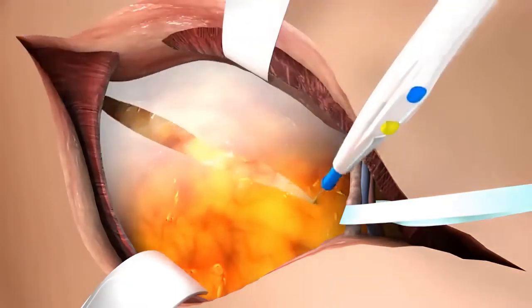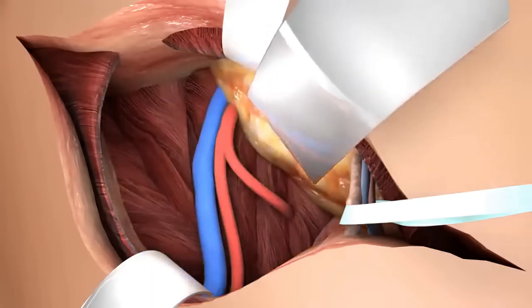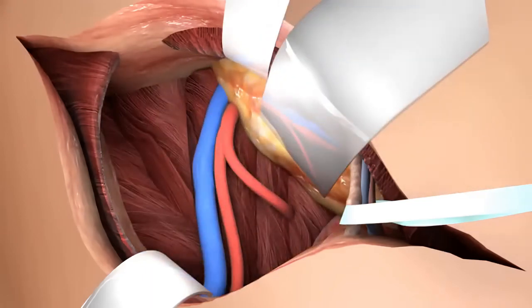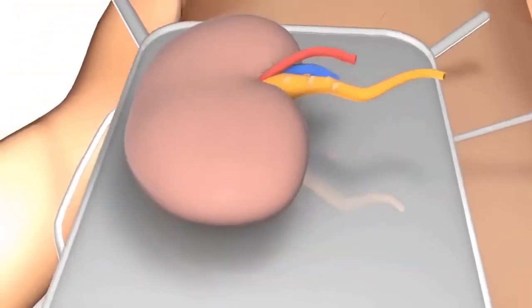The lowest part of the posterior rectus sheath is incised. After this, the retroperitoneal space is reached by gently pushing away the peritoneum. Its contents are held by a retractor. The common external and internal iliac artery and vein are identified and dissected from fatty tissue and lymphatic tissue to make clamping of the vessels possible. The iliac arteries are investigated by palpation for atherosclerosis.